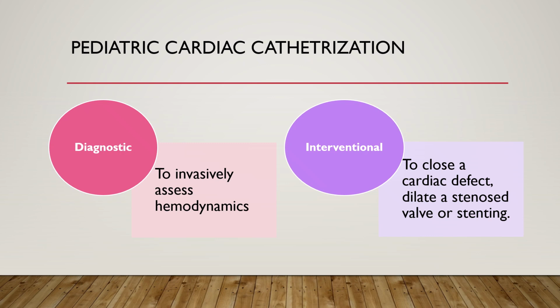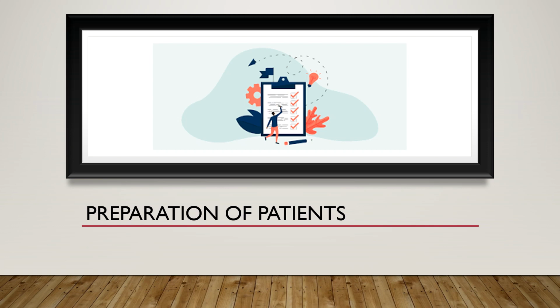Pediatric cardiac catheterization can either be diagnostic or interventional. Diagnostic catheterization aims at invasively assessing hemodynamics, while interventional catheterization aims at closing a cardiac defect, dilating a stenosed valve or vessel, or insertion of stents. How to prepare the patients?